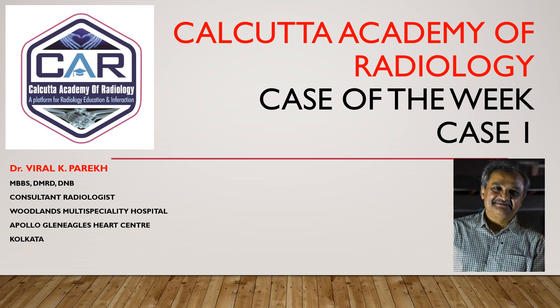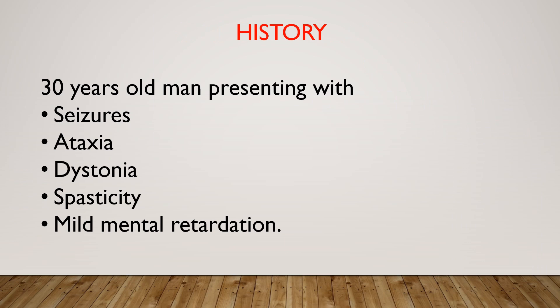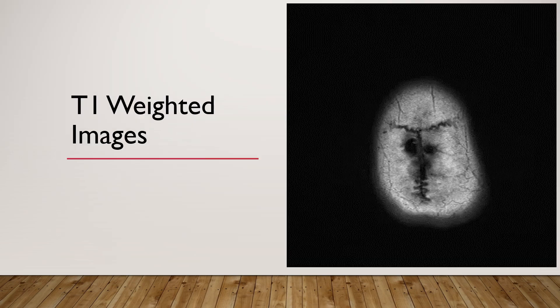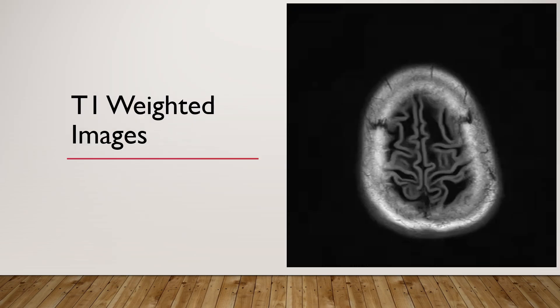Here is a 30-year-old man presenting with seizures, ataxia, dystonia, spasticity, and mild mental retardation. An MRI of the brain was done. Here are the T1-weighted images.